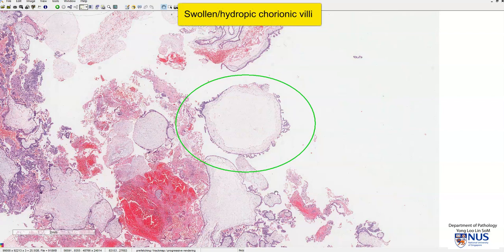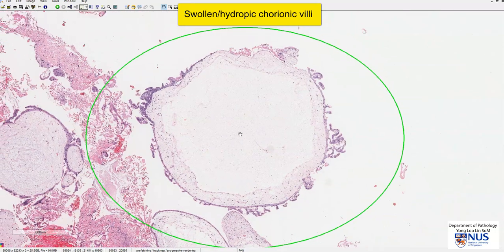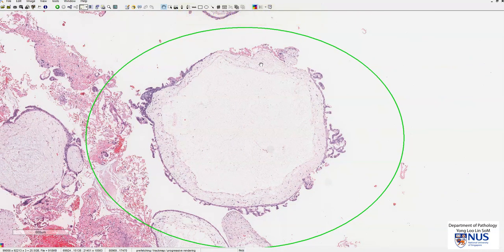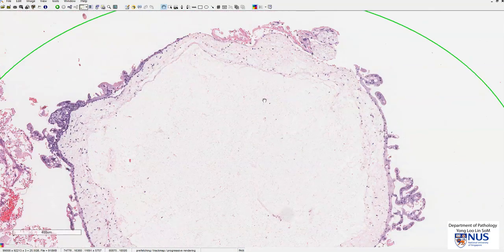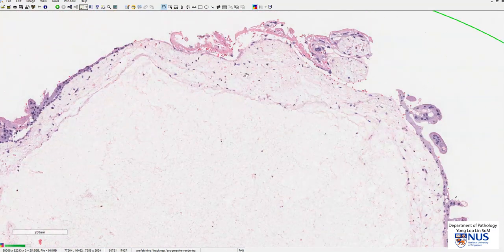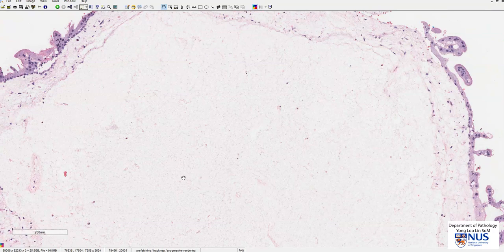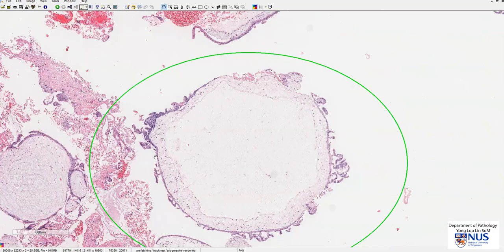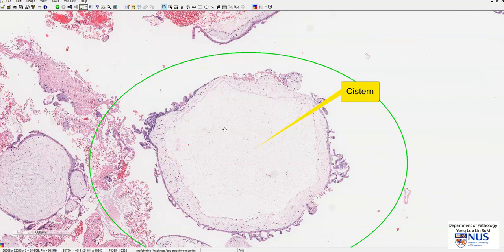A normal-sized villus would be much smaller. This hydropic villus is not only very edematous and swollen, it also has a central empty-looking area that is devoid of nuclei, as opposed to the presence of nuclei outside, with a little bit of fibrillary material in the center. This central empty-looking area is known as a cistern. Hydropic villi with cistern formation is a classical feature of complete hydatidiform mole.